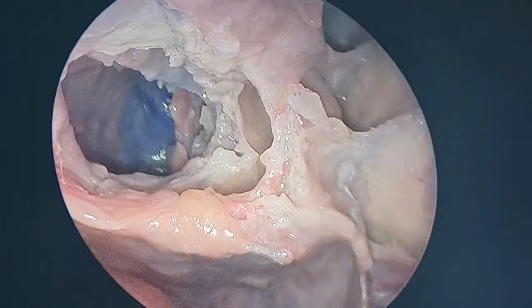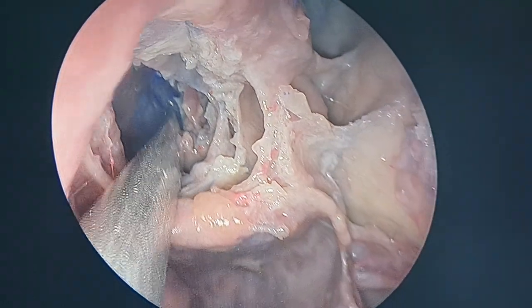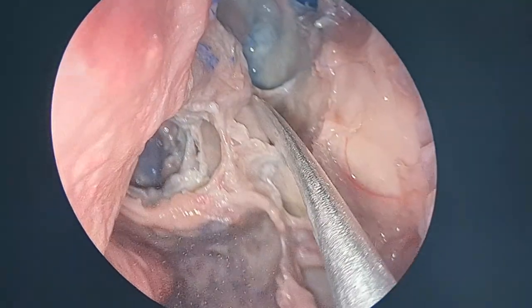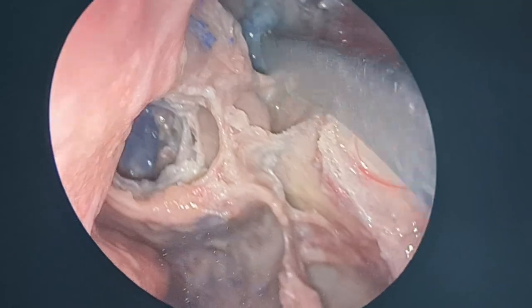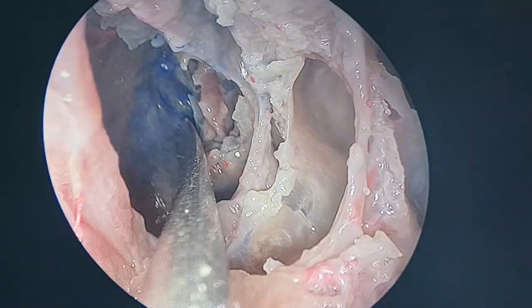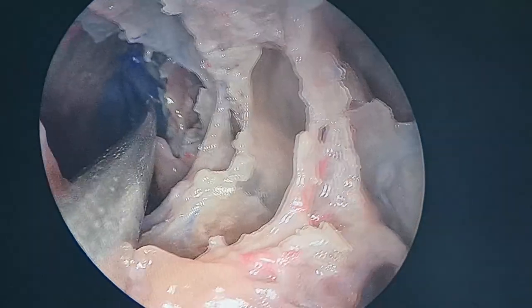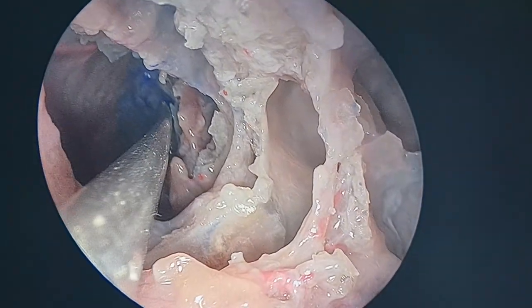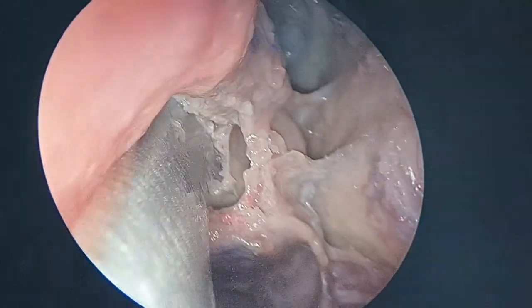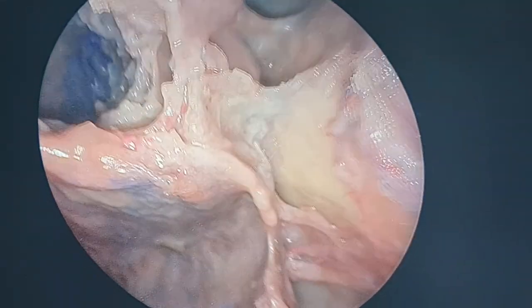Where to look for the sphenoid ostium? I will look for the sphenoid ostium even before I have done the posterior ethmoidectomy or anything else. I have not done the posterior ethmoidectomy; I intend to see the sphenoid ostium first because my optic nerve cannot come anterior to the sphenoid ostium in any given situation. So this way, if you see the sphenoid ostium first and then come anteriorly to the posterior ethmoidectomy, you are 100% safe. Got my point?